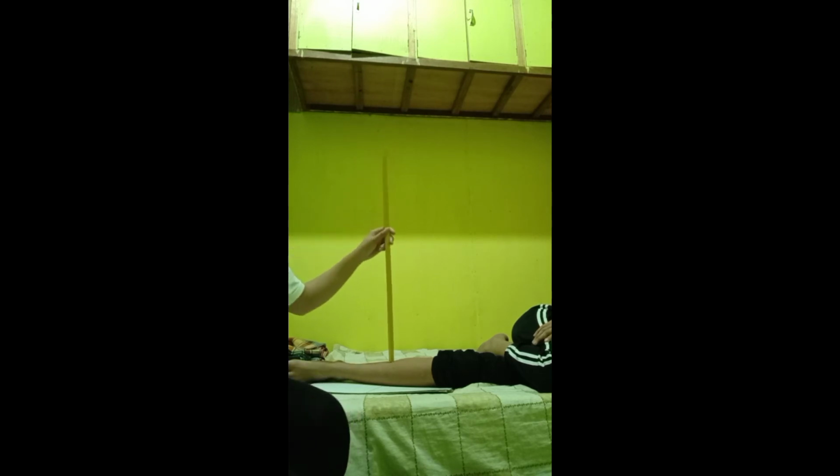The central ray is perpendicularly directed to the midpoint of the patient leg. This projection will demonstrate us the tibia and fibula and adjacent joints, just like the previous projection of the leg that I showed earlier.